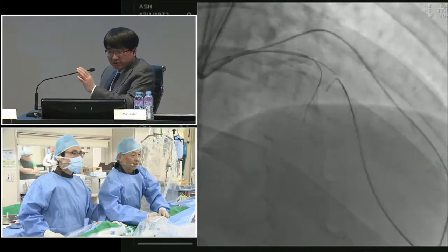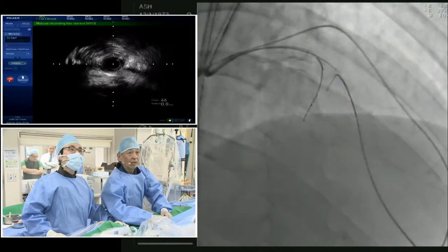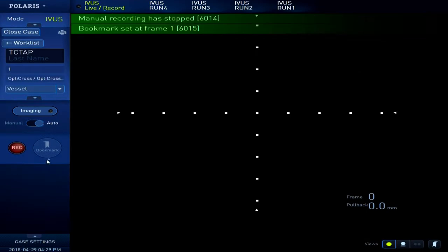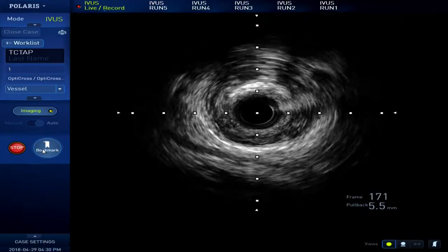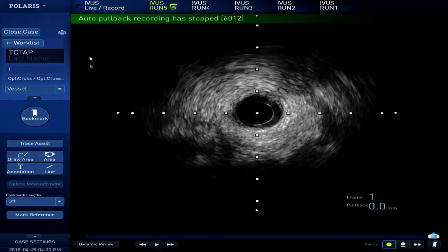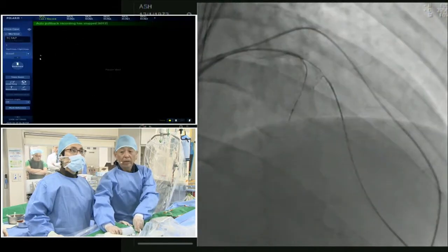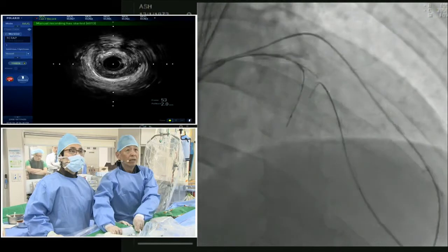Okay, I will check. Maybe this is not so bad. Okay, just behind. Please record. Pull back. Okay, how do you think? Maybe, because of calcium, we cannot detect clearly. Okay, live image. Manually, I'm advancing. Please show it in real time. But in this area cranial view, they are not synchronized.